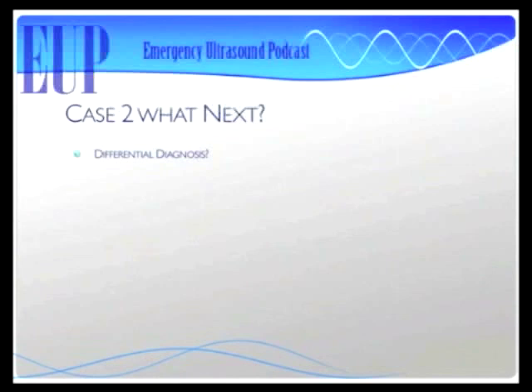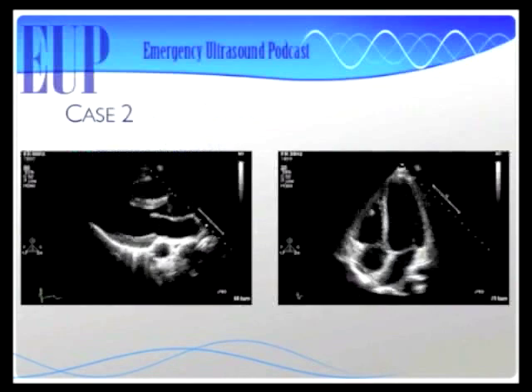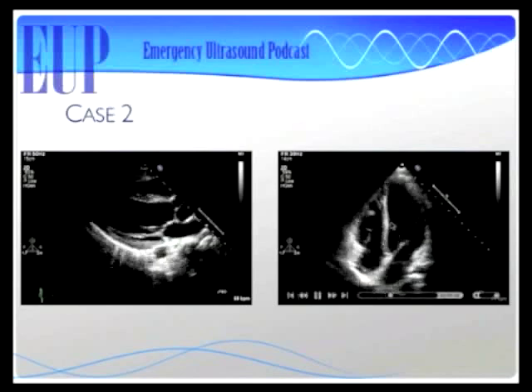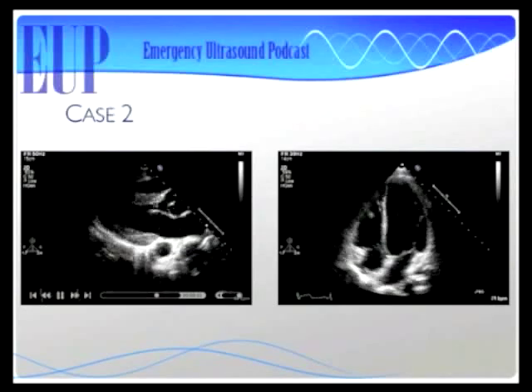So that's pretty interesting. But what I really want to know is, is ultrasound better than BNP? Can I basically use my ultrasound findings to diagnose CHF? To answer that question, I have to look at a different study, published in Academic Emergency Medicine in 2009. This study came out of Massachusetts General Hospital, and what they did is they created likelihood ratios for positive ultrasonographic findings of CHF and compared them to the likelihood ratio of a positive BNP. Their gold standard was the final diagnosis of congestive heart failure exacerbation.